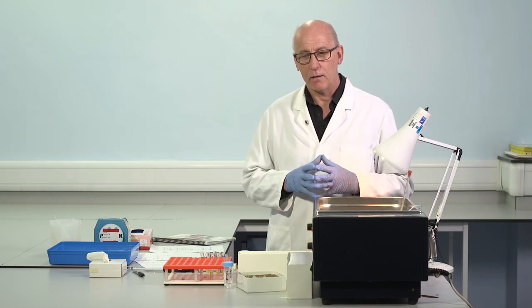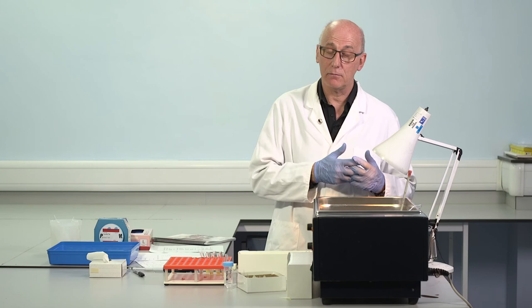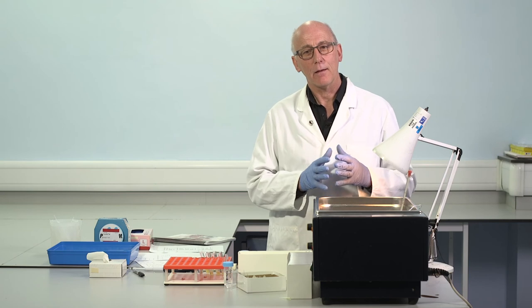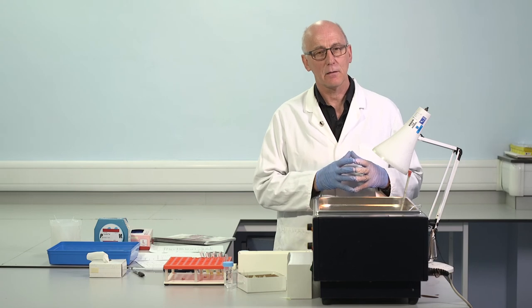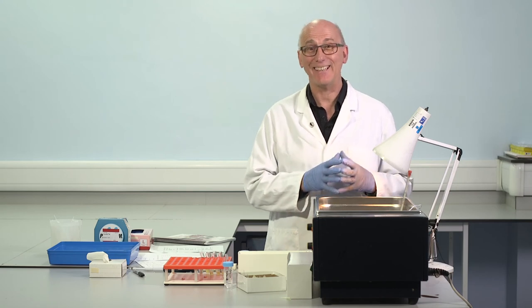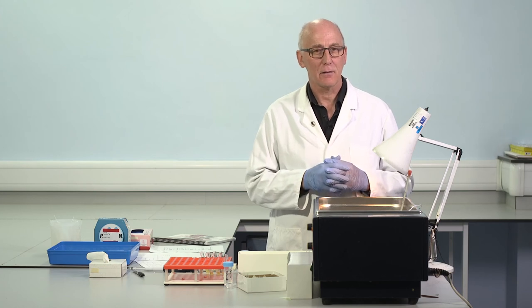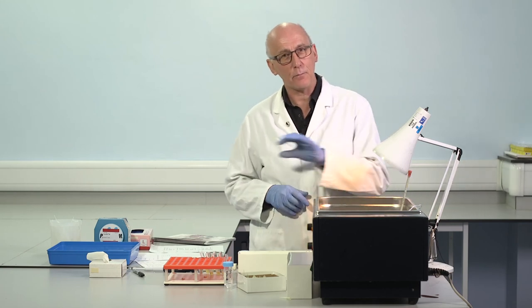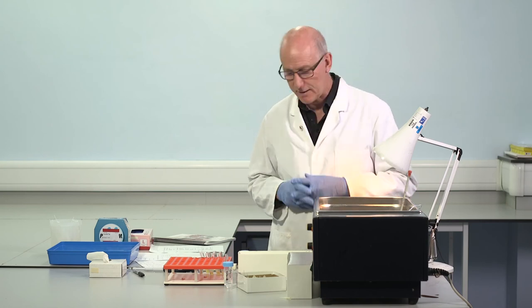So if we were dealing with a factor deficiency, the numbers may be slightly different, often are slightly different, but we will see, again, gross abnormality. Much higher phospholipid concentration. If we're dealing with lupus anticoagulant, that may have an important difference. It's likely the prolongation would be substantially less. If we're dealing with an antibody against factor VIII, we're going to see gross prolongation with any reagent. So by looking at the pattern with these two reagents, we may be able to draw some conclusions about the test plasmas.